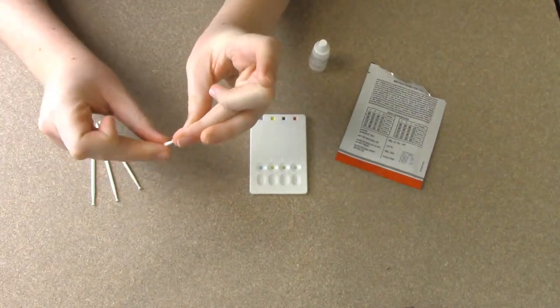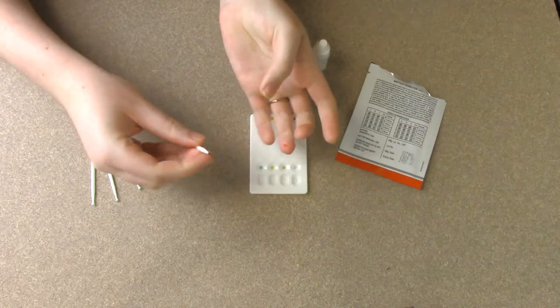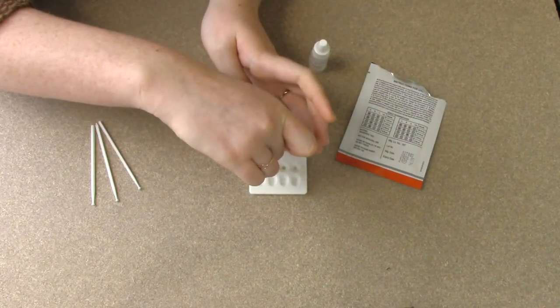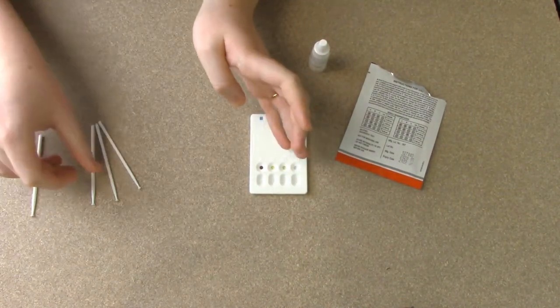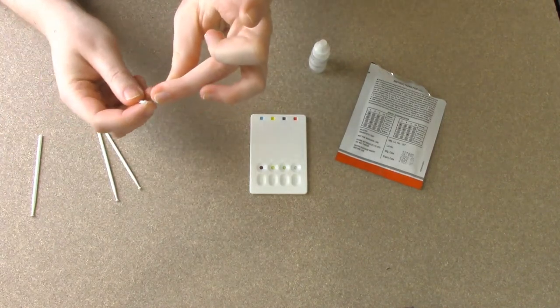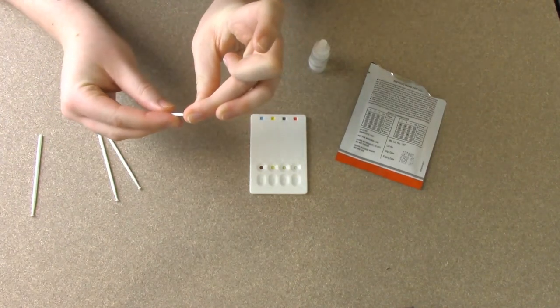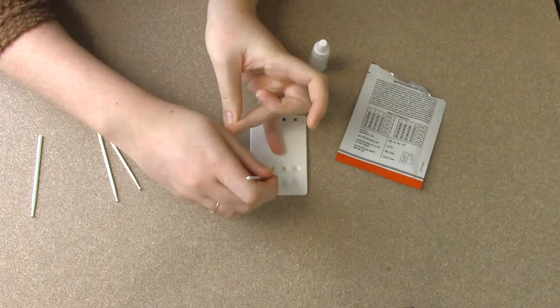You take your first sample stick, collect a droplet of blood and stick it in A for about two to three seconds. We're going to repeat that. I'll get another sample. I'm using gravity to help me out here to keep that blood dripping.